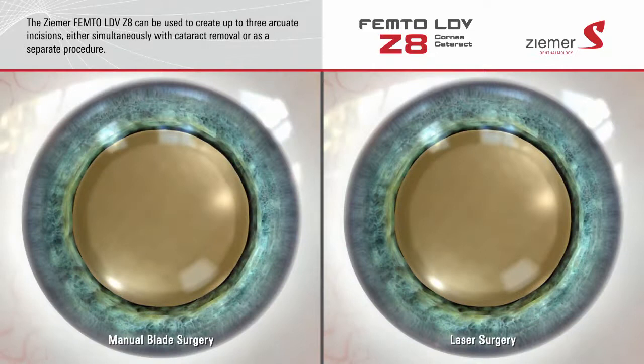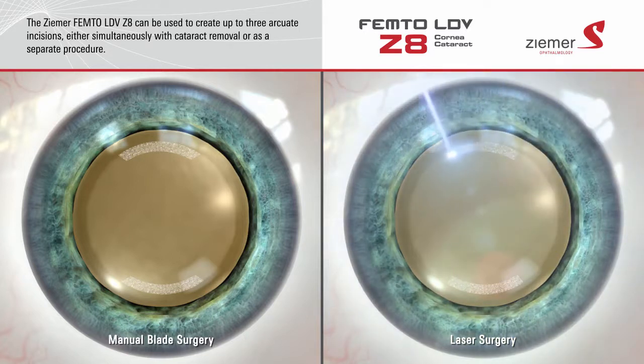In addition to its applications for cataract surgery, the Zeemer Z8 laser can be used to create up to three arcuate incisions on the surface of the cornea. Rather than cutting these incisions with a blade, the Z8 delivers an incredibly fast sequence of low-energy laser pulses, which form ultra-precise microscopic bubbles at a pre-programmed depth and length to make the incision. The results are precise to within one hundredth of a millimeter.